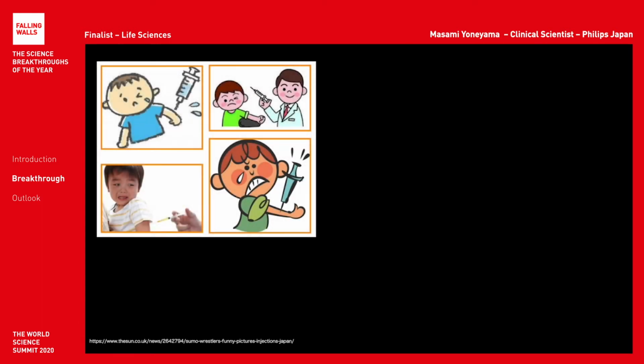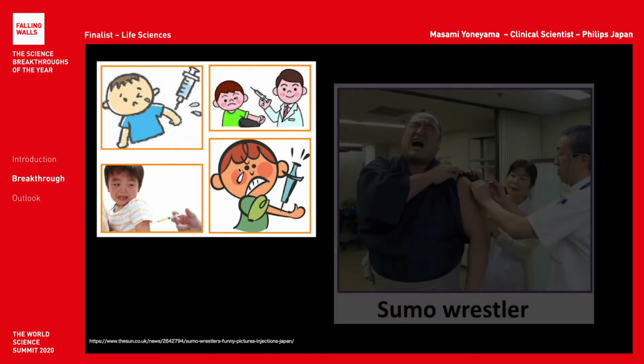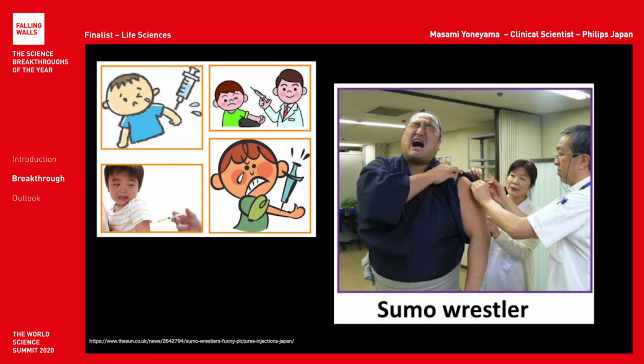In my work, very often you realize that imaging or scanning a child is such a big challenge. In particular, if you want to check for any vascular diseases, you always have to inject a contrast material for visualization of the blood vessels. Even for magnetic resonance imaging (MRI), which is normally considered non-invasive because no radiation is used, still a small cut in the skin is needed. This is invasive, extremely uncomfortable for the kids. This is costly in both money and time. Also, good image quality is not always guaranteed.